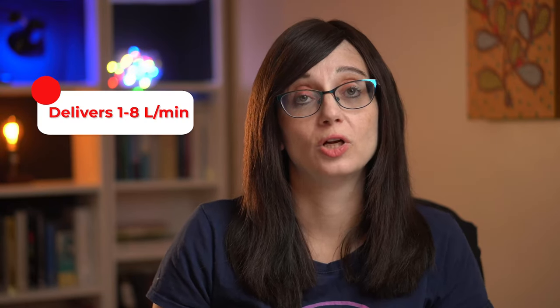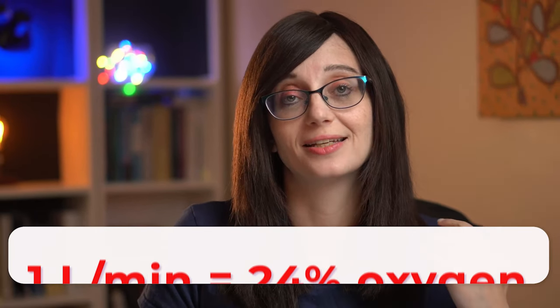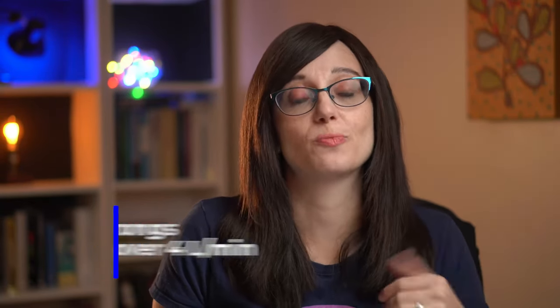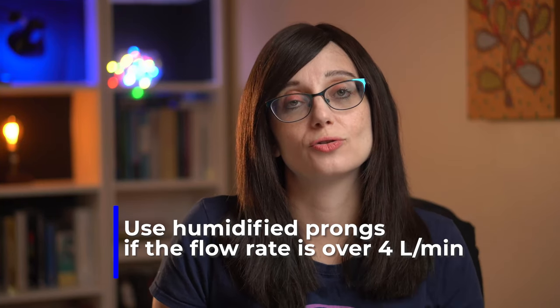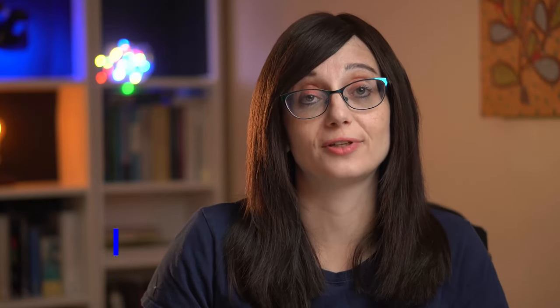Nasal cannula can deliver between one and eight litres per minute flow with varying FiO2s. At one litre per minute it'll be delivering 24% oxygen, and at six litres per minute it'll be delivering 44% oxygen. If you want flows over four litres per minute, then you're going to want to use humidified prongs. And if you're going to use a flow of less than half a litre per minute, you're going to need a low flow meter to be able to deliver that.